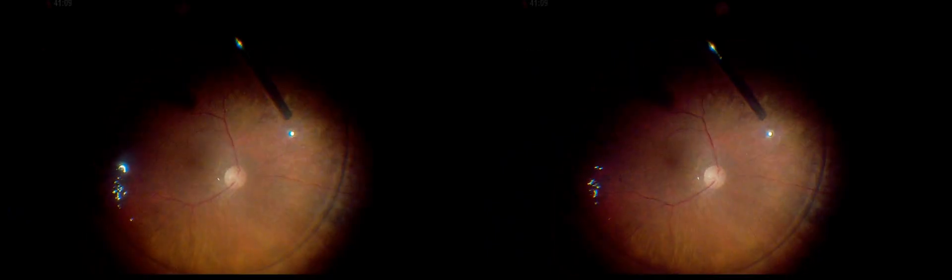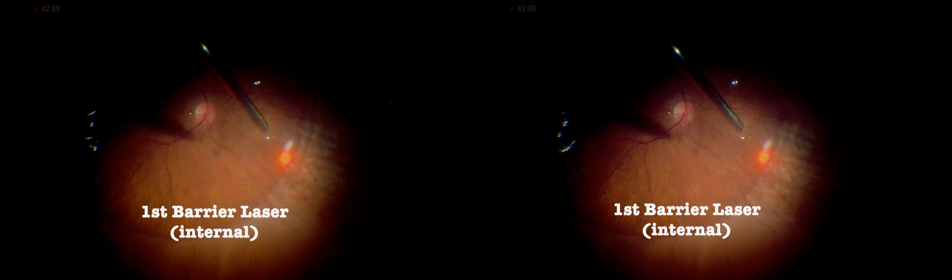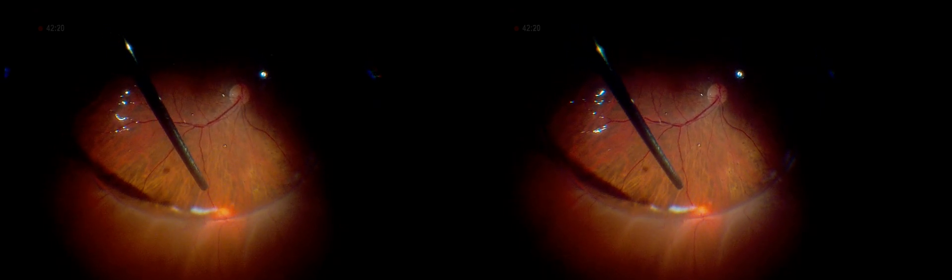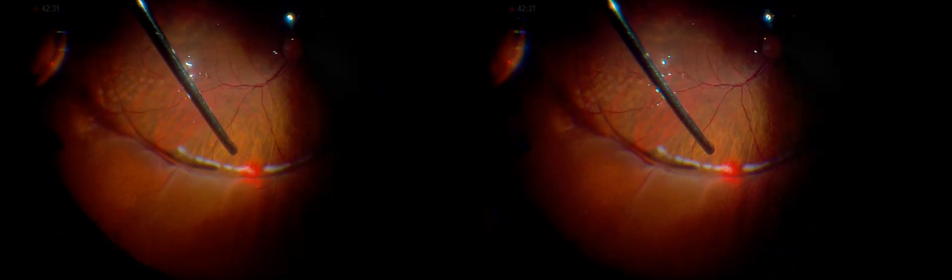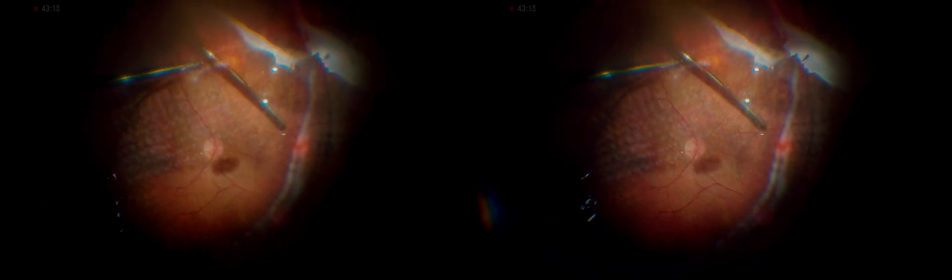Additional perfluorocarbon liquid is required to access the extreme periphery. By further flattening the retina, an initial internal laser pass is applied, preparing the area for additional peripheral laser spots later. A 360-degree barrier laser was then applied.